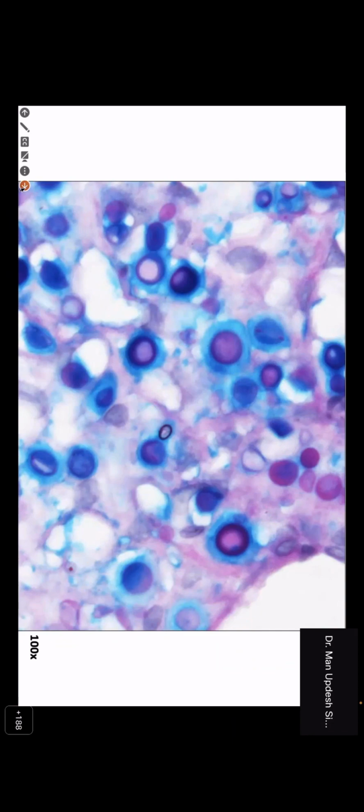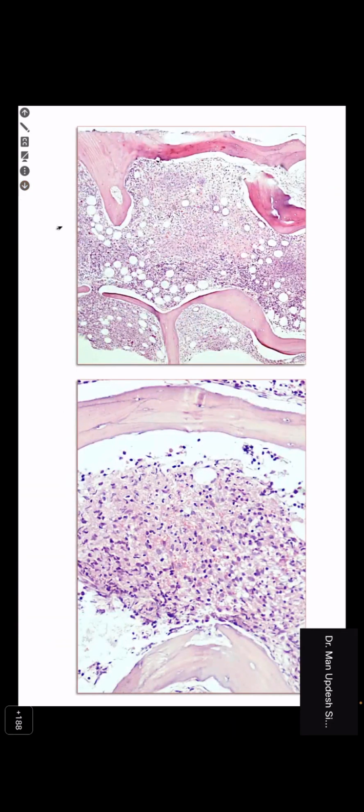And in this scenario, you might find also granulomas. There's another patient, post bone marrow transplant. I don't remember the years, but this is probably more than a year later. And you see granulomas, epithelioid cells, and that's another infection we need to look for. There can be other kinds of infection, and you need to identify organisms which can look like fungus at times.